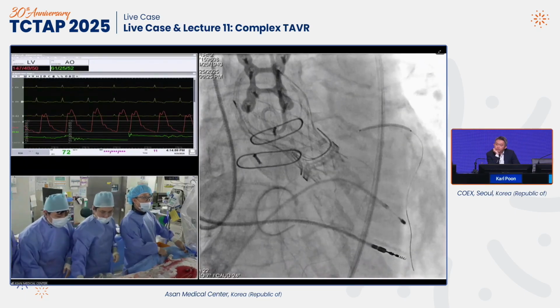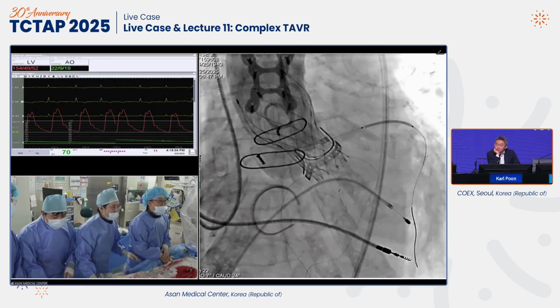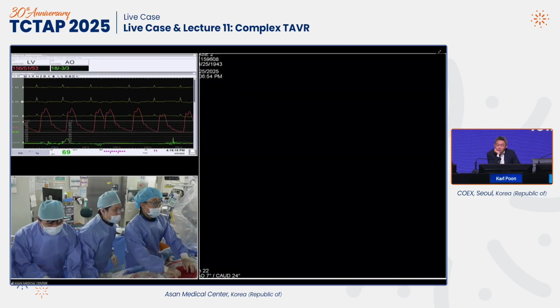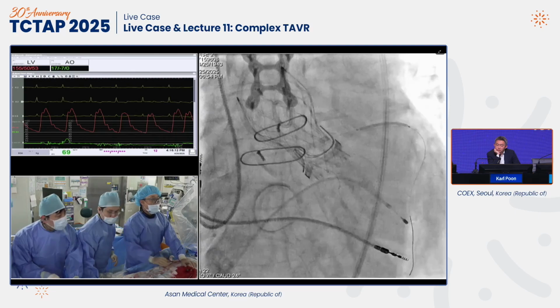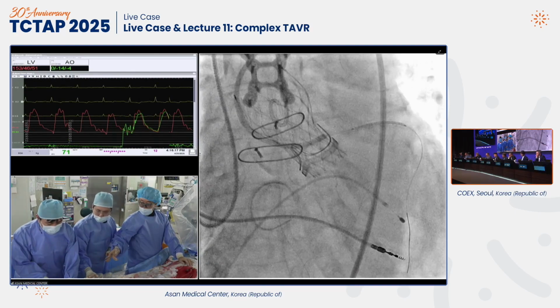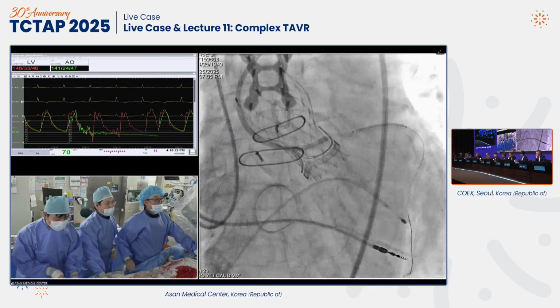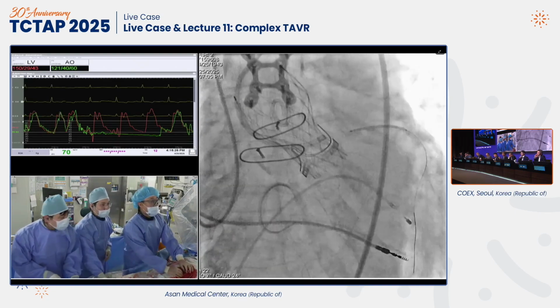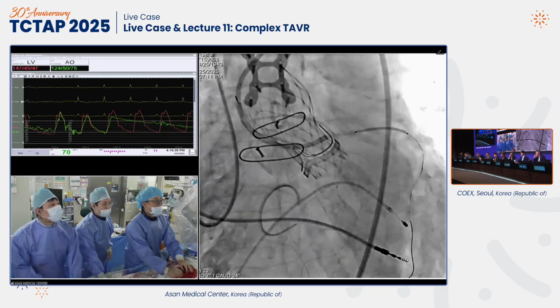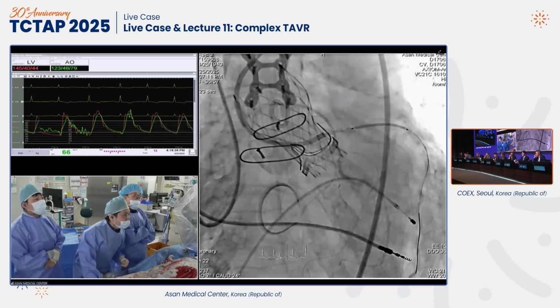Okay. Let's shoot from here. What about intravascular ultrasound? Are you ready? Do you think there's a role there, David? Push shot. Where's the coronary? Let's shoot the coronary here. Ready? Test. It's okay. Yeah, I mean it's filling. It just can't see it. Test. There you go. Okay, we will check it over here. Let's shoot. Angio. Push shot. Perfect. It looks good. Yeah. So I think it looks good, and the flow is okay.